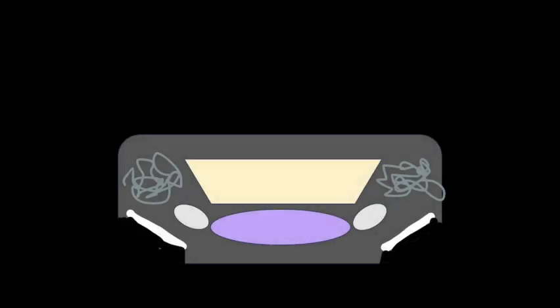Again, standard imaging technique for these structures is through use of a transvaginal ultrasound probe. However, I do want to show you the tip I have for imaging these structures using a transabdominal technique. Let's pretend that this very professionally drawn graphic represents a transverse cross-section of the pelvis, with the yellow trapezoid representing the urinary bladder, the purple oval, the uterus, the gray ovals, the ovaries and the adnexal regions, and these little squiggles on either side here representing loops of bowel, which will commonly overlie and obscure the adnexa. Here, I'll add an ultrasound beam path that we can use for transabdominal imaging of the uterus.